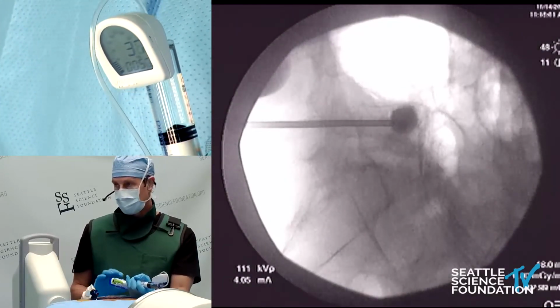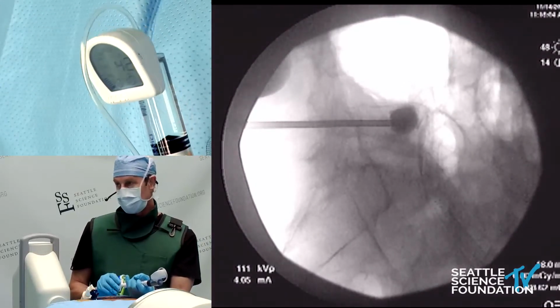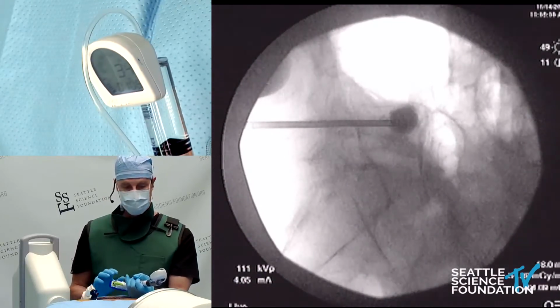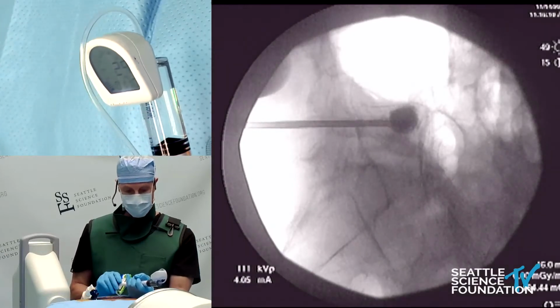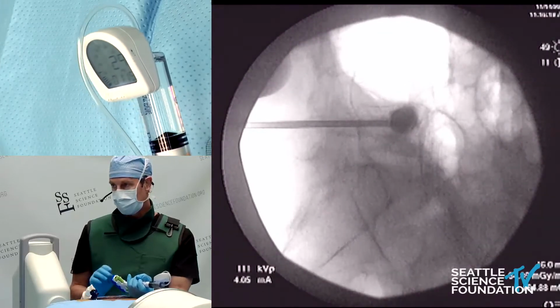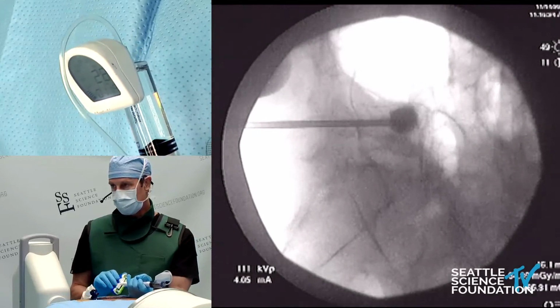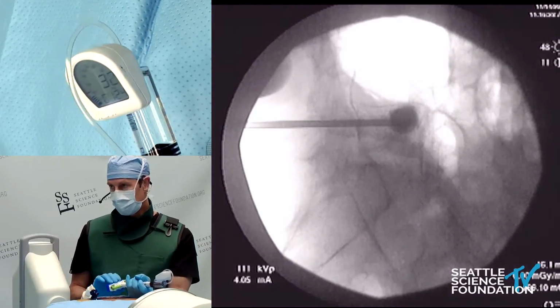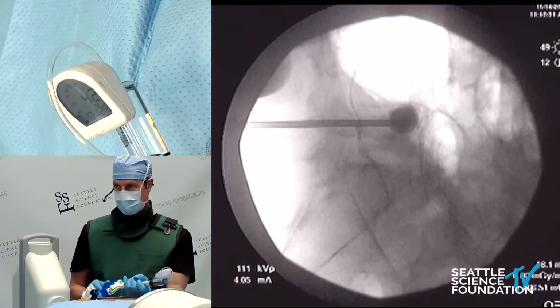Working time in the cement is more than adequate. It's about 12 minutes working time, and really you can get a lot more out of that. And I've worked with this cement all the way up to about 16, 17 minutes, still going. So we see a little bit of that contrast going out, but the cement staying in. You can always tell the cement, because it's viscous, the contrast is not as viscous.